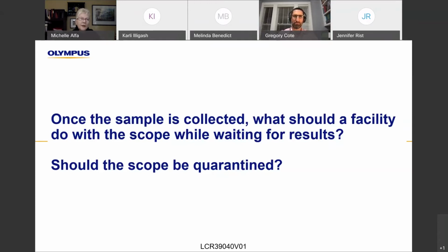Mm-hmm. I think the other tricky thing that's good to talk about at this point, and I think you mentioned it earlier, is that the FDA protocol also doesn't specify the frequency with which to do culture if you choose to do it. I noticed some of our responses coming in on the website, and I know some centers may do it infrequently and others do it very regularly. But I think it is optimal that every week there should be some, if you're going to do this, especially at the beginning, even if you do it for the first time and you're wanting to see what's existing in your center.